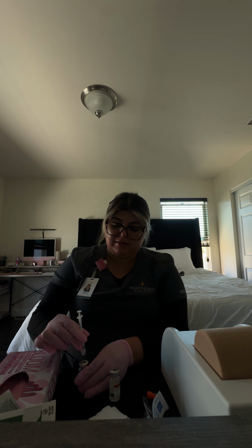So once we have confirmed that, we're going to go ahead and inject it into the NPH, or intermediate insulin, and without pushing in any medication, we're going to withdraw up to 12 units now. Perfect. So we have 12 units in total here.